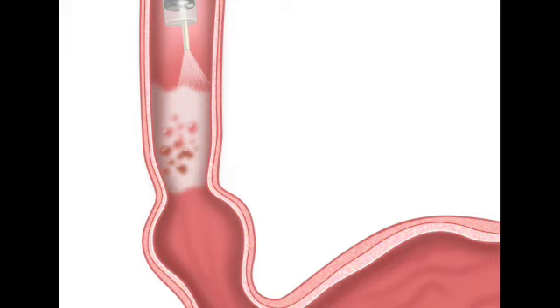Right, and it's the absolute definition of diagnostic muddy waters. Because the changes happening at the cellular level, the dangerous ones anyway, can be virtually invisible. Because they haven't actually caused a lump or a bump yet. Exactly. They haven't caused any major structural changes. So to a gastroenterologist looking through an endoscope, a patch of healthy tissue and a patch of precancerous tissue can look completely identical. Which brings us to today's deep dive.